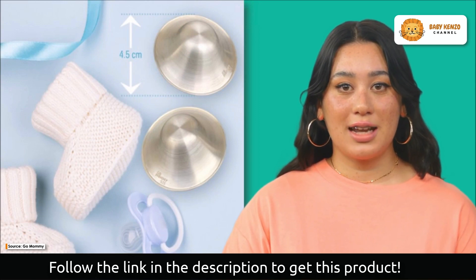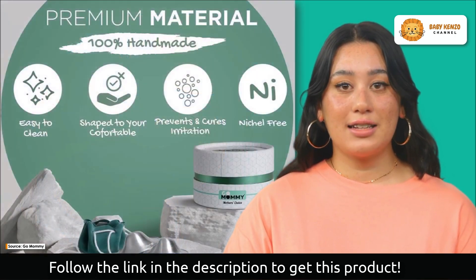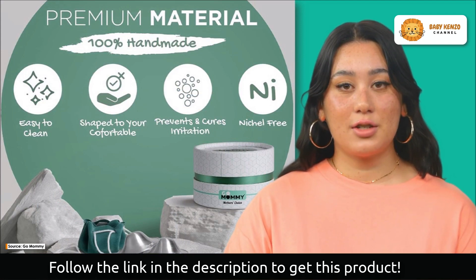The silver nursing cups include a self-cleaning mechanism, making the cleaning process incredibly simple. In the case of milk residue buildup, a quick rinse with water and patting them dry is all it takes to keep them clean and ready for use.